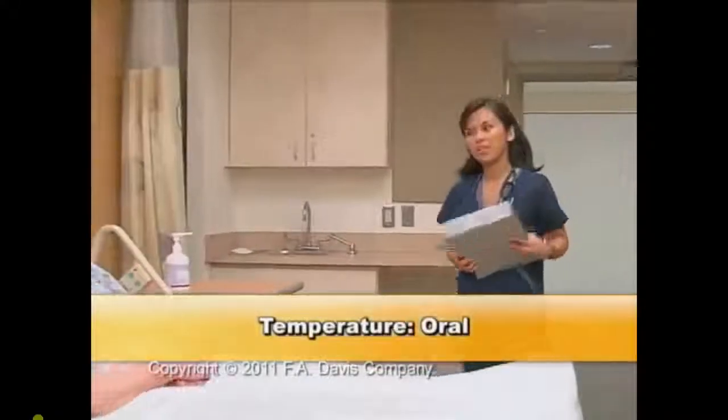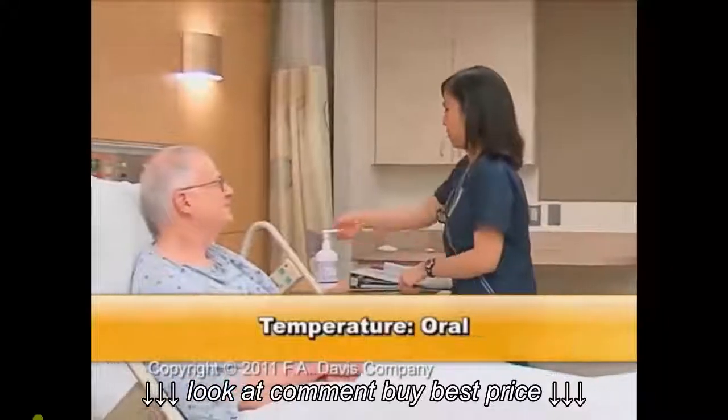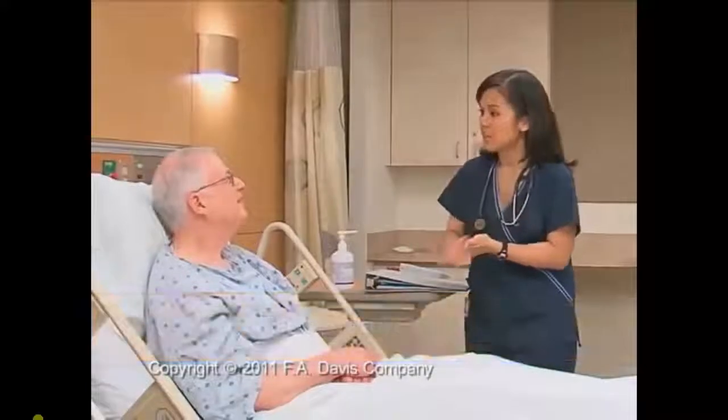Performing the procedure, follow the universal steps that apply. The nurse is using an electronic thermometer for this procedure.